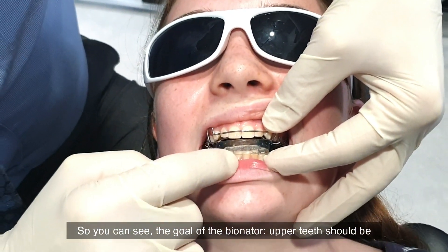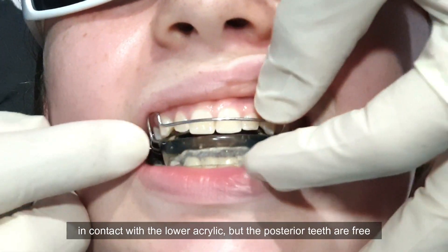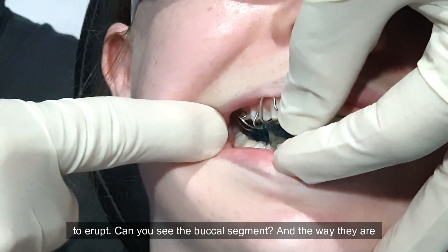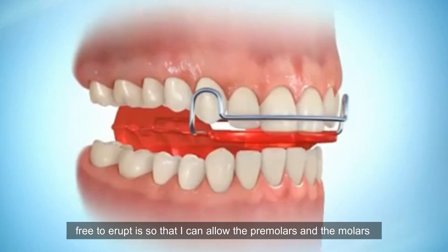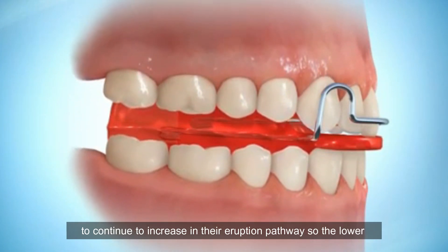Right, put that in — great, perfect — and bite together. You can see the goal with the bionator: the upper teeth should be in contact with the lower acrylic. But the posterior teeth are free to erupt. Can you see the buccal segment? The way they're free to erupt allows the pre-molars and molars to continue erupting.